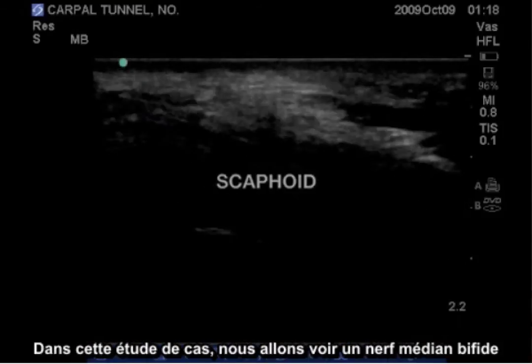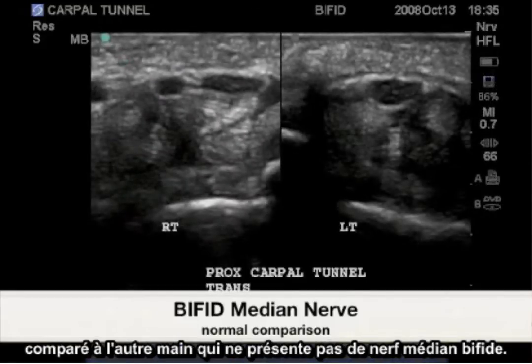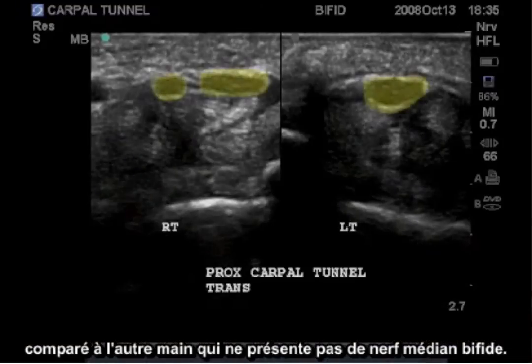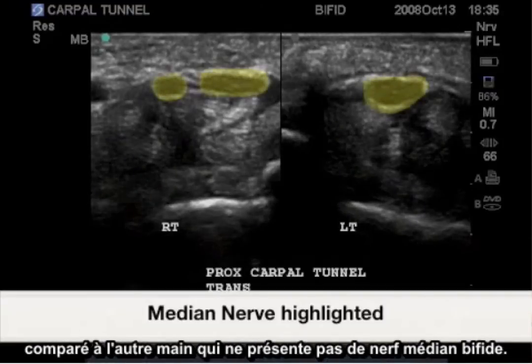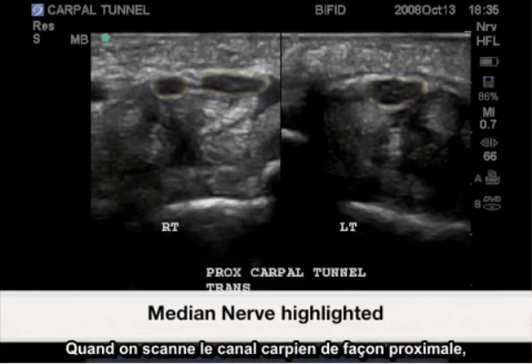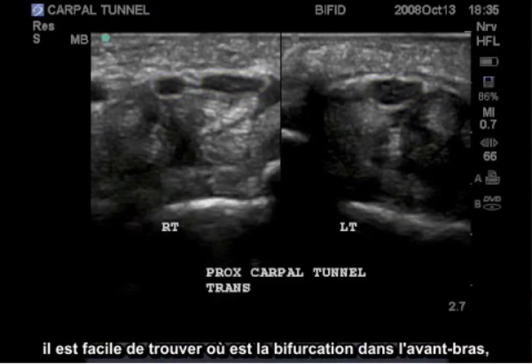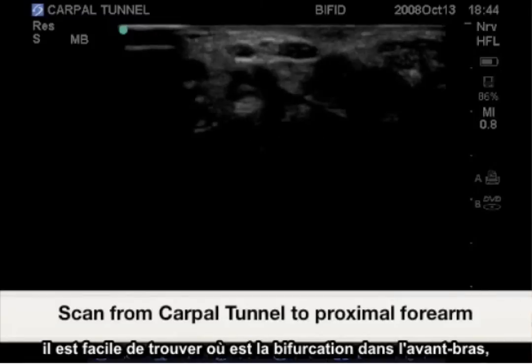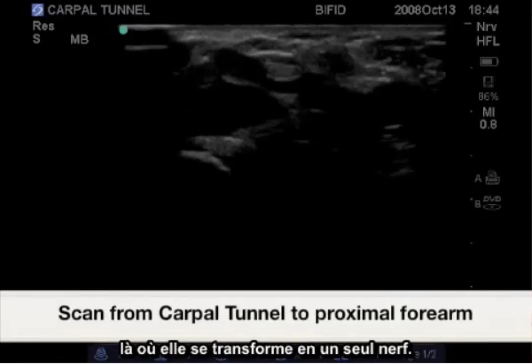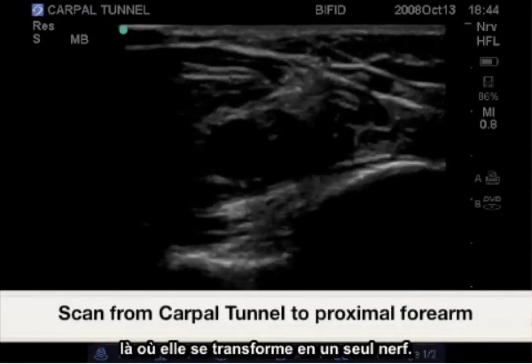Here is a case study involving a bifid median nerve with a comparison to the other hand showing no bifid median nerve. When scanning from the carpal tunnel proximally, it is easy to identify where the bifurcation takes place in the forearm, showing this becomes one nerve.